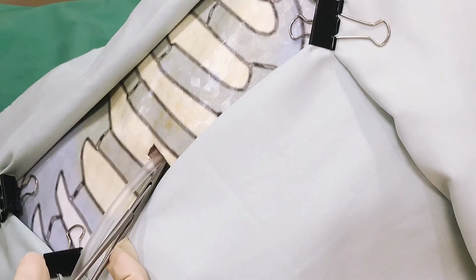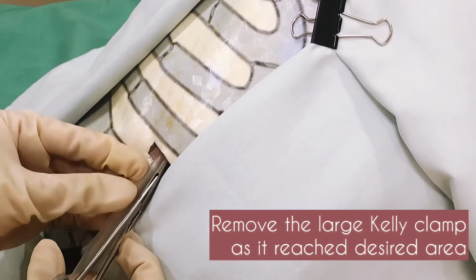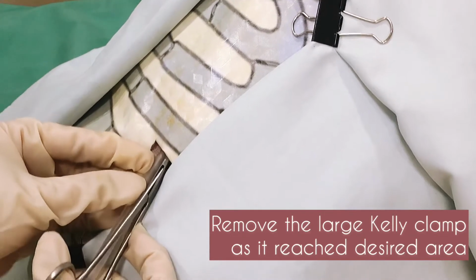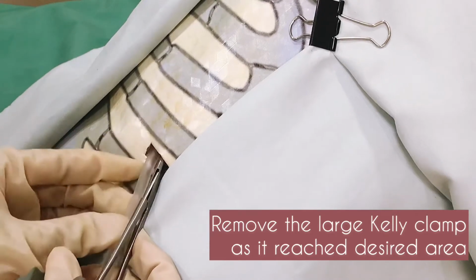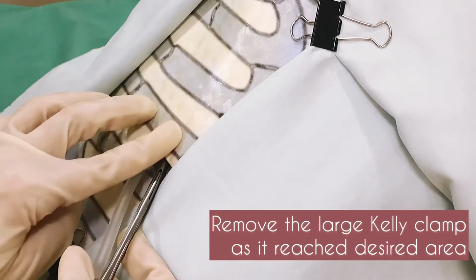Remove the large Kelly clamp as soon as the tube reaches the desired position in the chest, but do not remove the smaller clamp marking the point of emergence of the tube. Palpate to ensure that the tube has entered the chest.